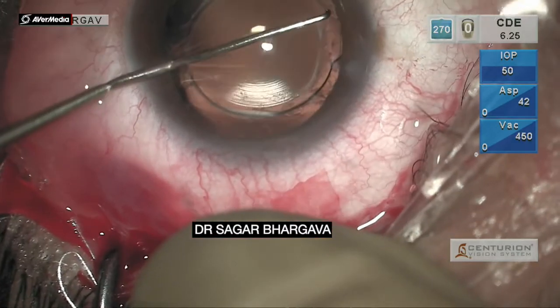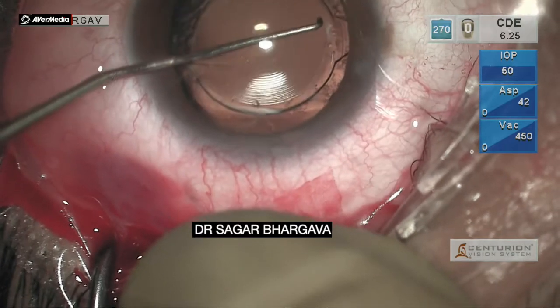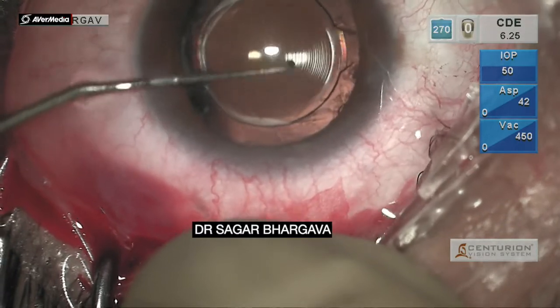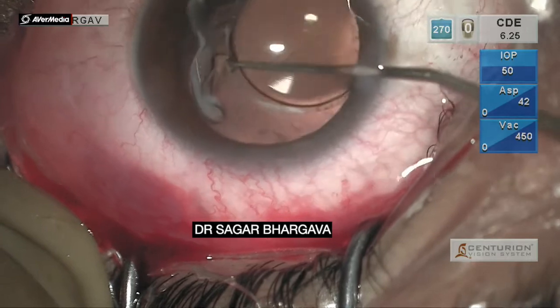Now the first attempt to bring the haptic out of the bag. You can see that there is a significant amount of fibrosis. As a result, getting the lens out will not be an easy procedure.